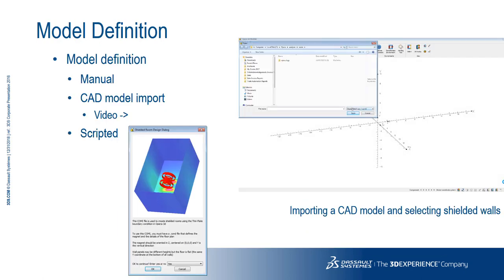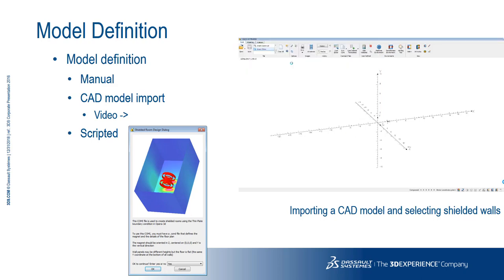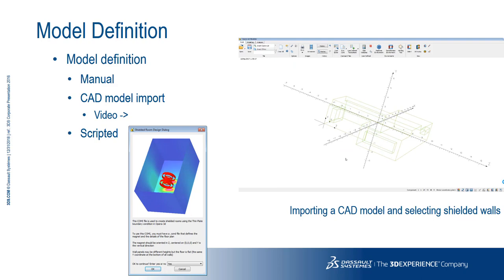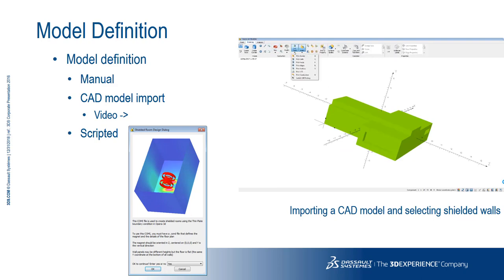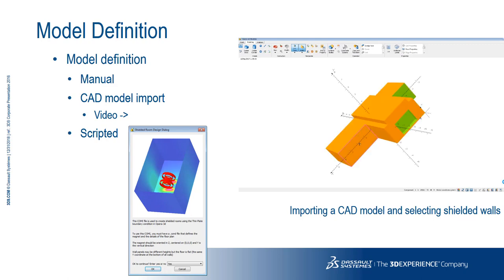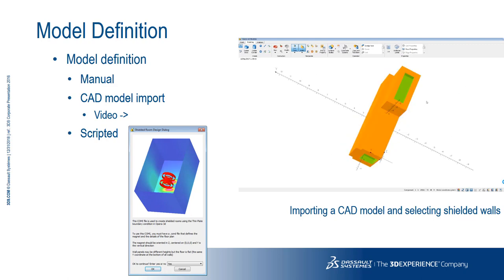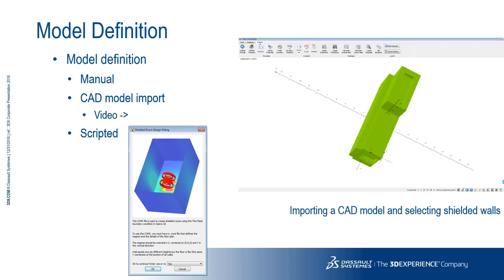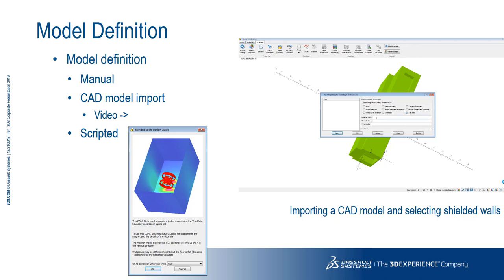When it comes to defining the model in Opera, you have a number of choices. You can define geometry using Opera's own modeller, where primitives are created and operations can be carried out to intersect, combine, and trim. Once the room geometry is defined and properties for the various materials and magnet are set, the whole problem is enveloped in air for solution. Alternatively, you can read a model of the room from a CAD file, which again shows the ease of use of the thin plate boundary condition — the user need only select the walls that are shielded with no requirement to create thin meshable volumes by sweeping walls. This process of reading a STEP file and selecting the shielded walls is shown in the video that's playing. Finally, all of this can be scripted to automate the process. Contact us if you'd like a copy of the sample script for your own Opera installation.